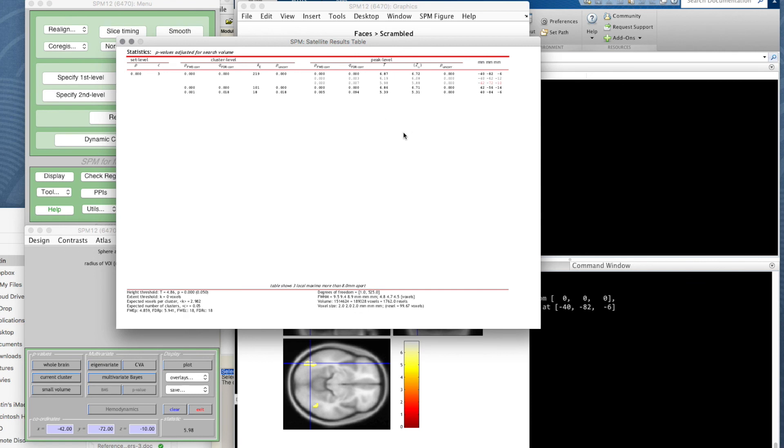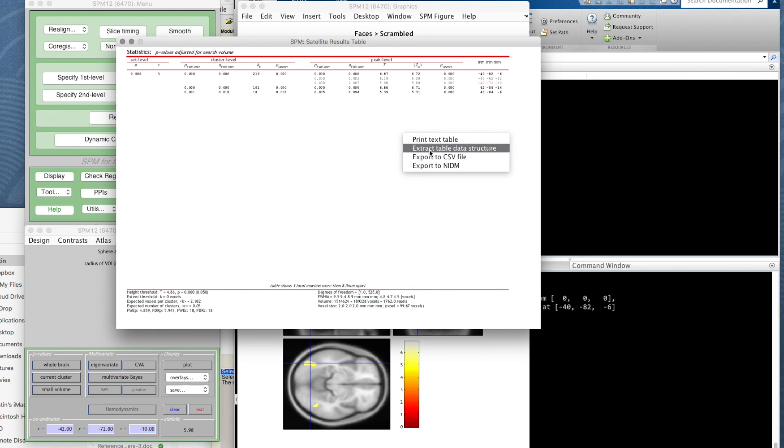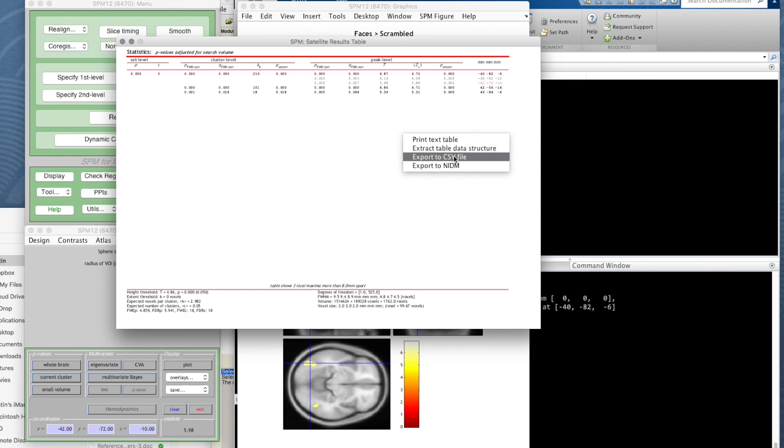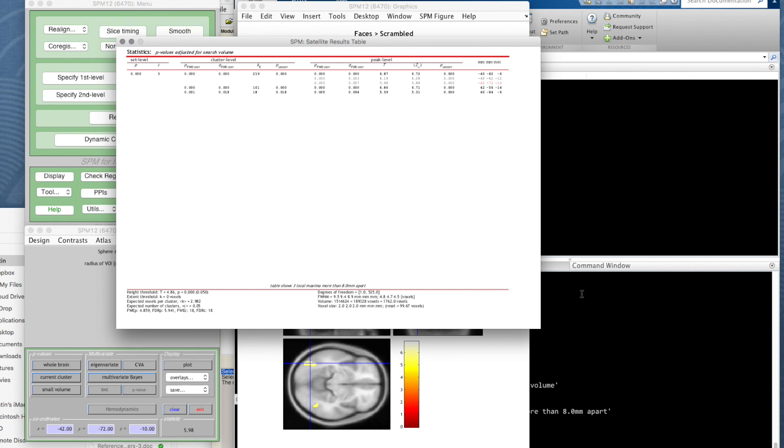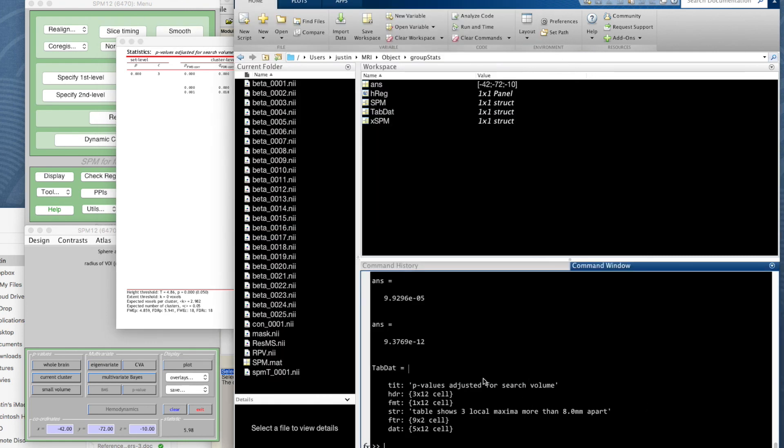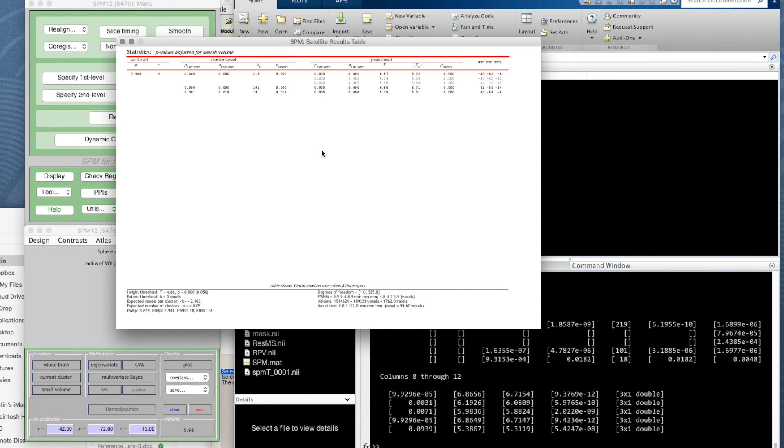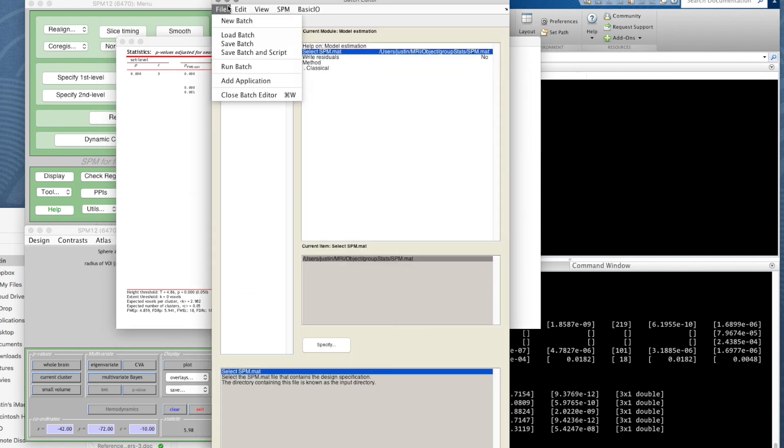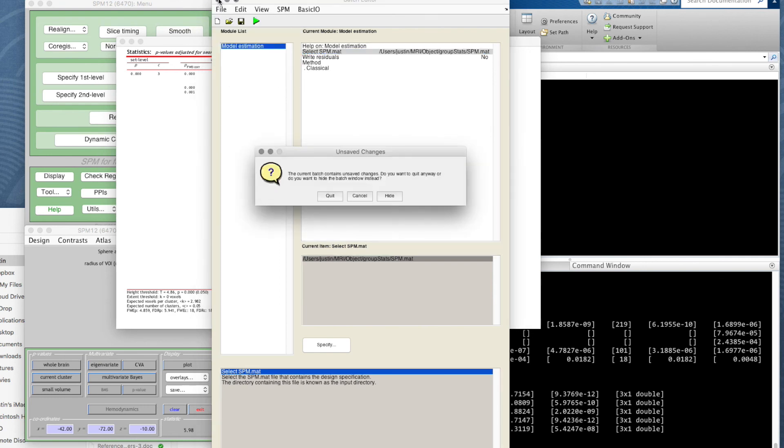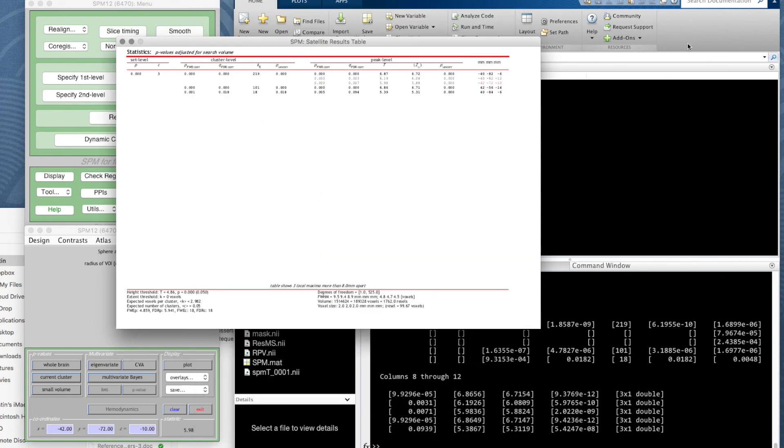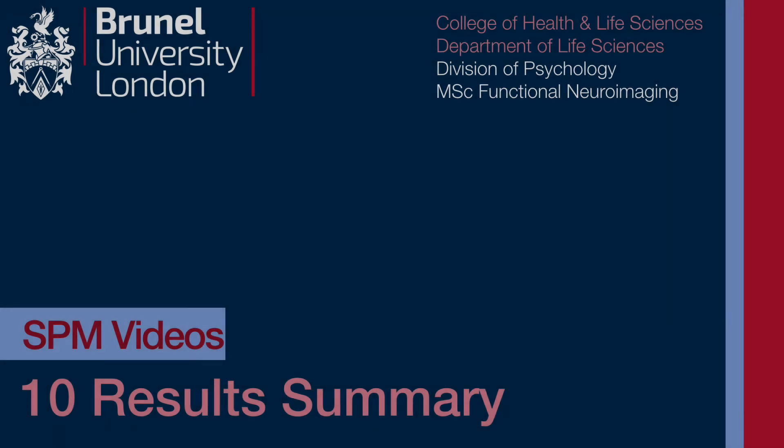Now we've got this results table. It's typically almost impossible to read on screen. If you right-click on there, you can print it out, you can extract that as a MATLAB data structure, or you can export it as a text file, comma-separated values, if you want to read that into something else like Excel for plotting or summarizing or tabulating the data. If I just extract the table data structure, we'll find that we now have in MATLAB a structure called table data with a title, header, format, and the data in there.